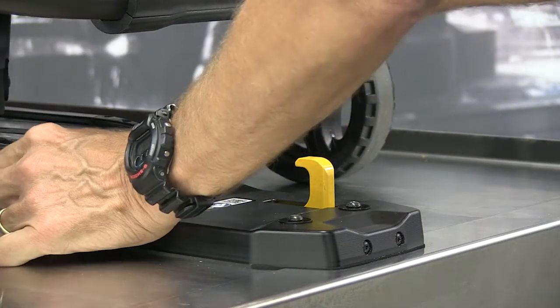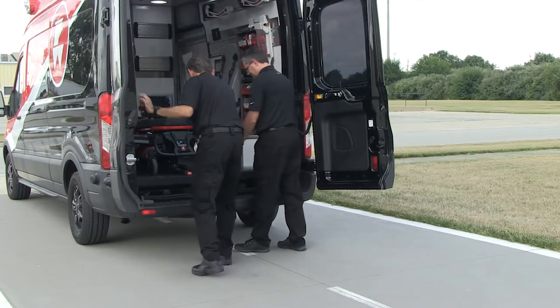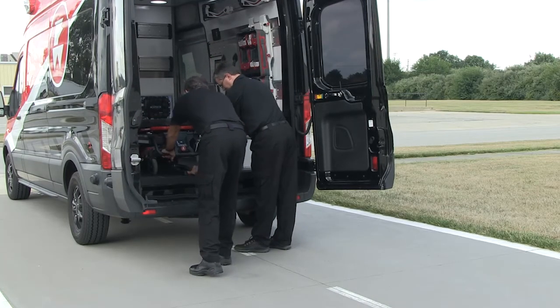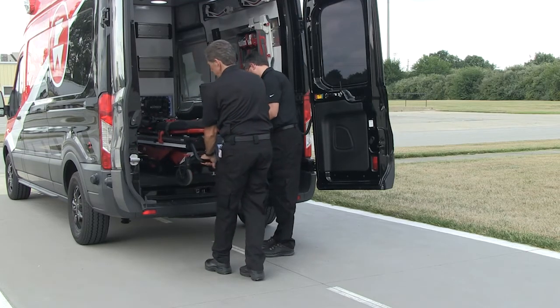Push the red release button to unlock the product and allow it to be removed from the fastening system. If the button is difficult to press, push the product away from the nose of the fastening system to free the lock mechanism.